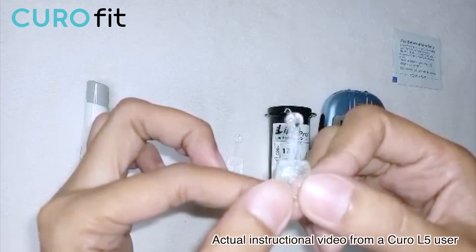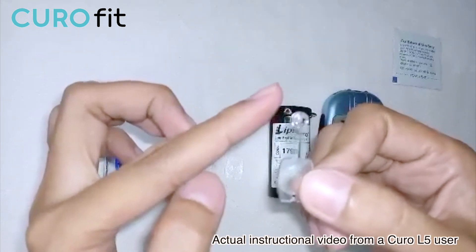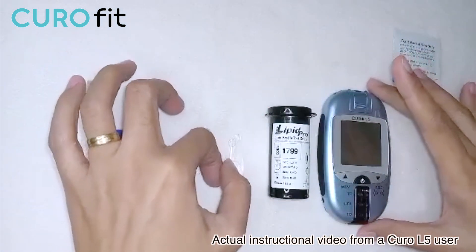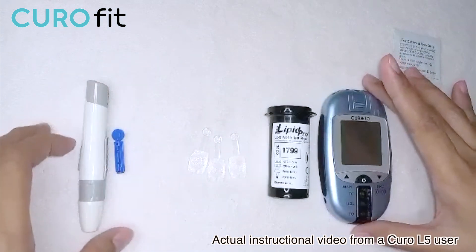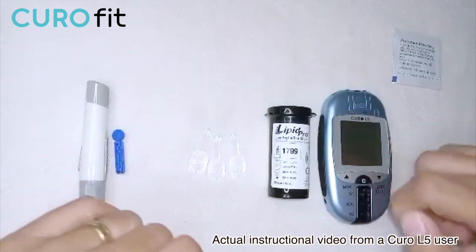Let me show you the capillary rod. There's a half moon shape on the capillary rod collection area. We need to fill this with our blood sample. The Curo L5 device requires a 5 microliter amount of blood. It is very important to use this capillary rod — it's for both infection control and accuracy purposes.